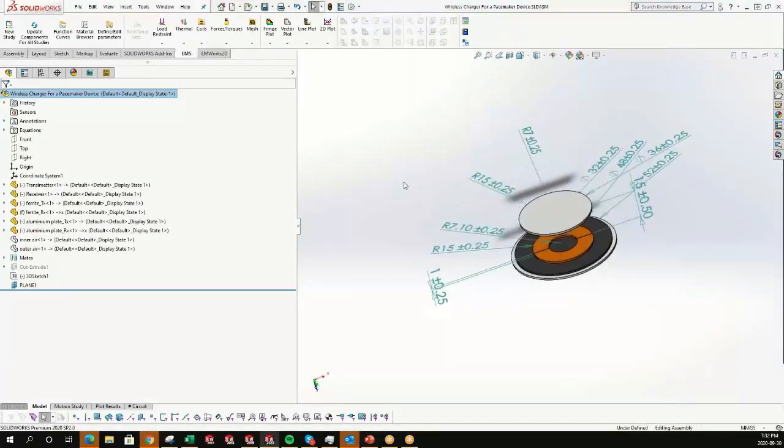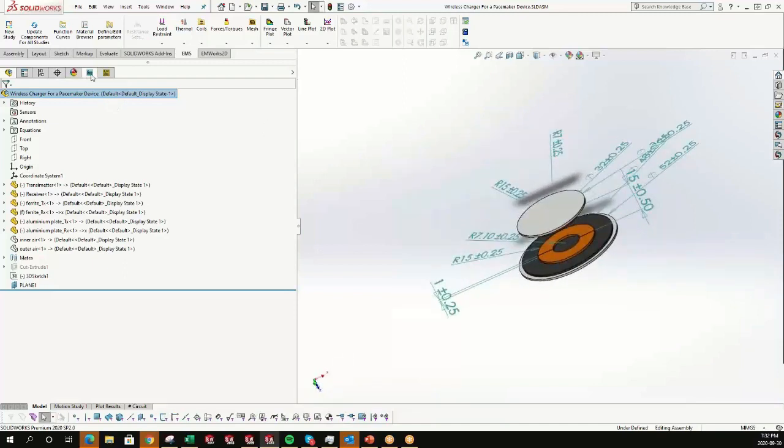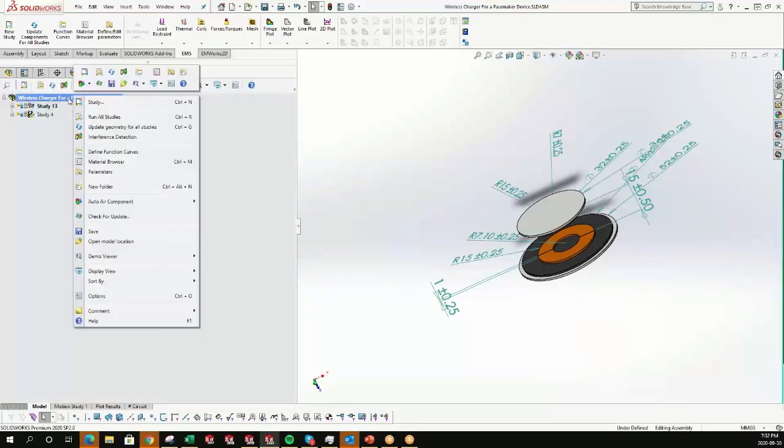So EMS, as we said earlier, is fully embedded inside SOLIDWORKS, so they both have the same look and feel. We can move from the SOLIDWORKS model to the EMS tab by clicking this icon. We can find the assembly here. We can just right click and use the first option to create a study.